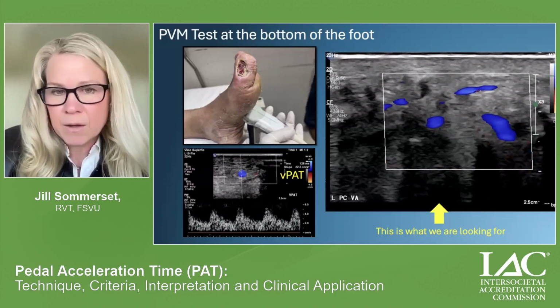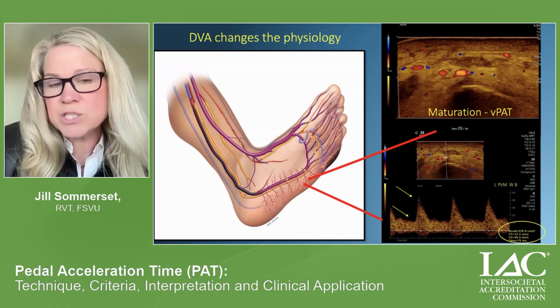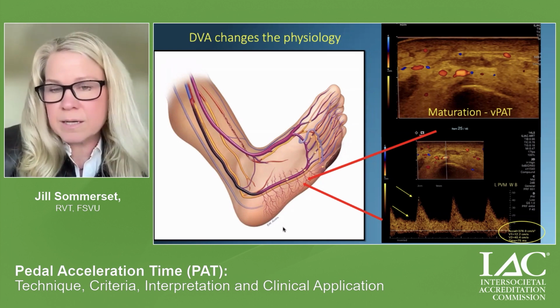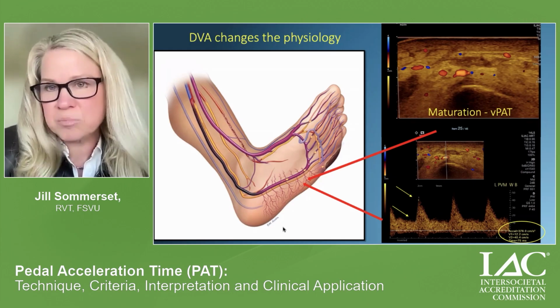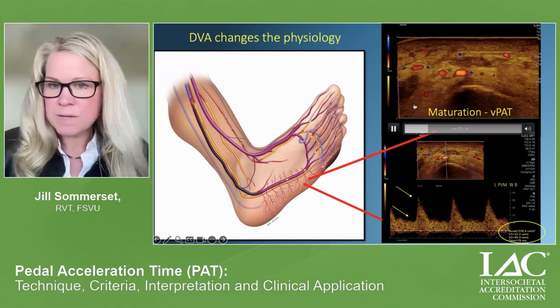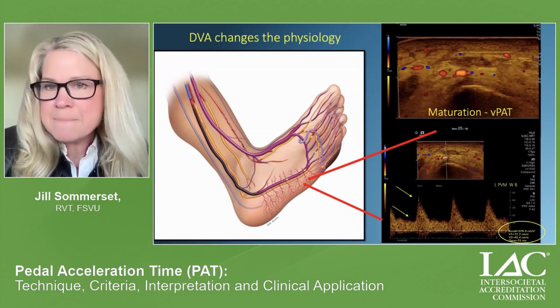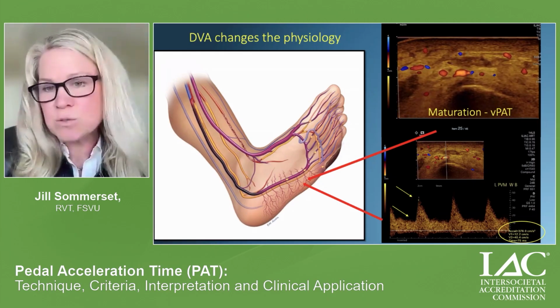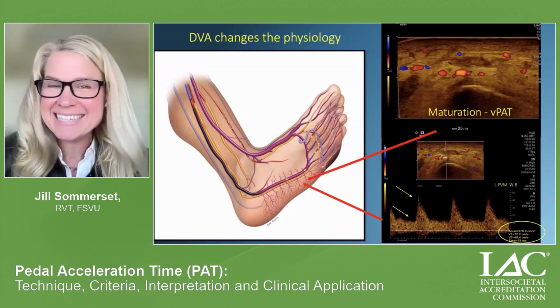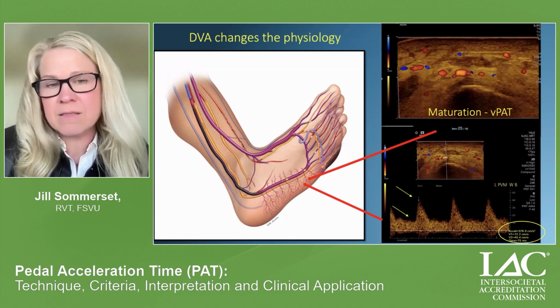And this is really, really helpful because we know that with DVA the circuit doesn't stay open long. We just need it open long enough to get the neovascular network established and to have positive pedal venous maturation. And in this patient, their DVA has been down, and you can appreciate all these serpiginous arterialized veins in the tissue going to the wound bed with a measurable arterial waveform. So I think this is a really exciting time for vascular ultrasound to play such a significant role in following these patients post-operative DVA.